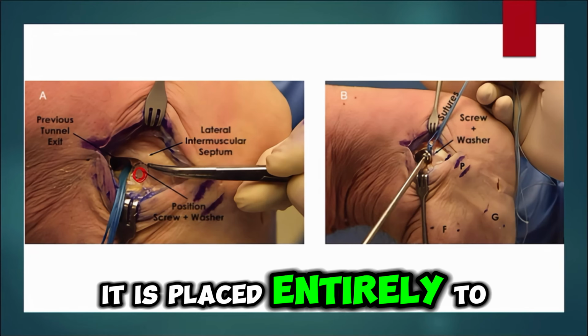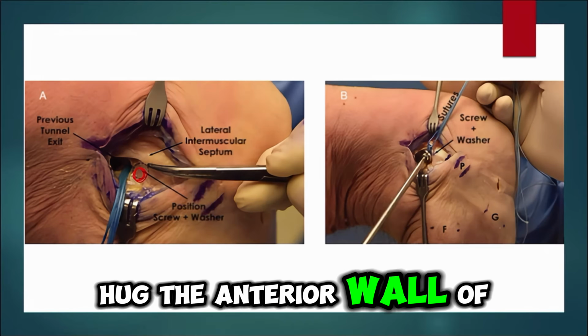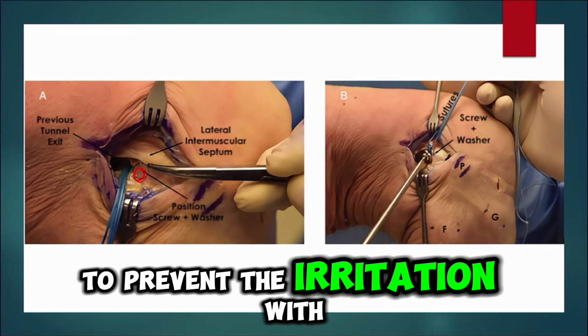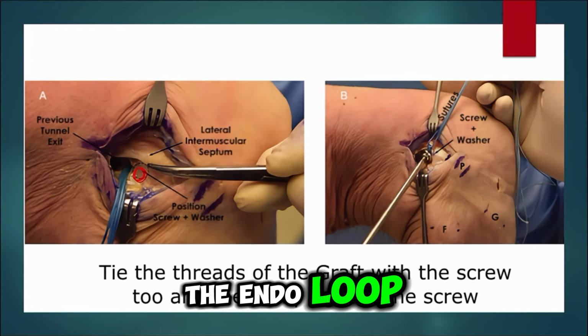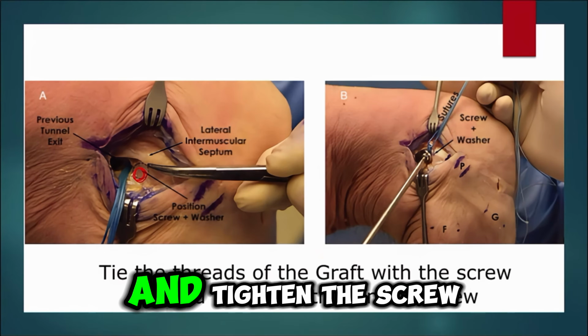It is placed anteriorly to make the graft hug the anterior wall of the femoral tunnel, and inferiorly to prevent irritation of the iliotibial band. And if we are also using the endo loop, the endo button, just place the loop around the washer and tighten the screw.